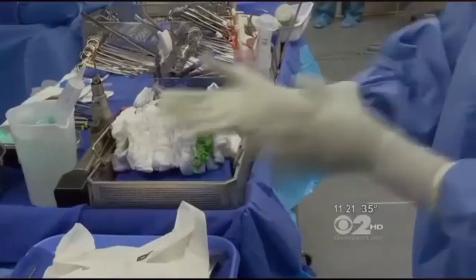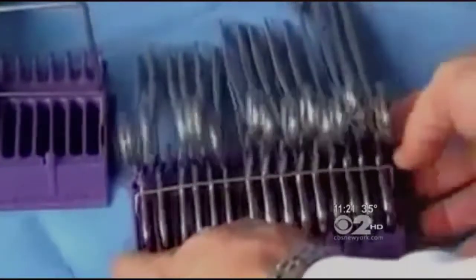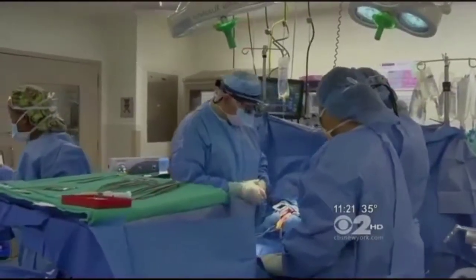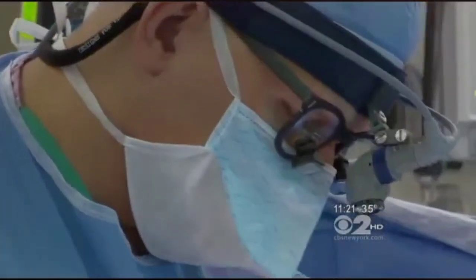And there are other technologies and tools for tracking surgical instruments. Different RF technology can track instruments that may get left behind. And here, a simple plastic case can visually account for other surgical items. None of the technological adjuncts substitute for the surgeon's role. The surgeon has to do a wound examination before they begin to close.